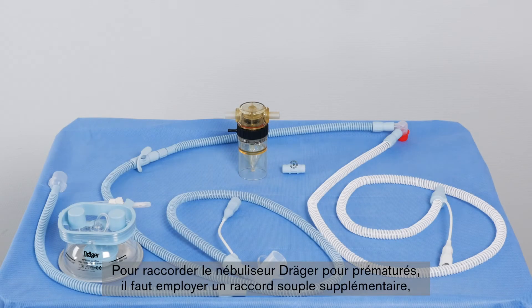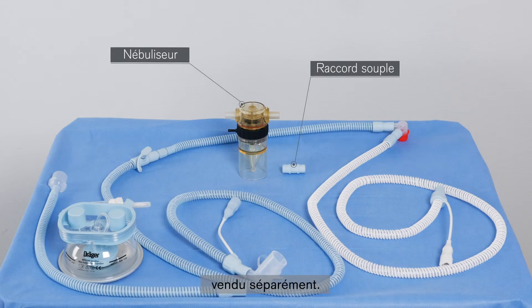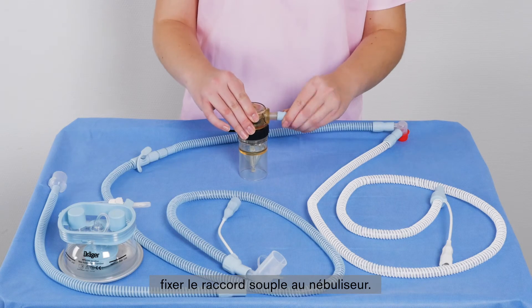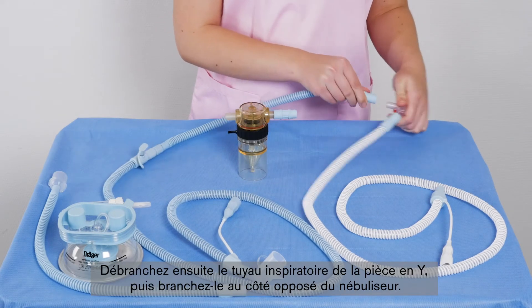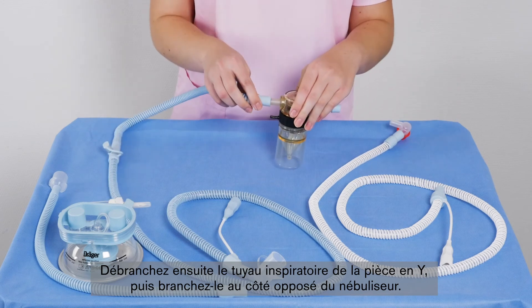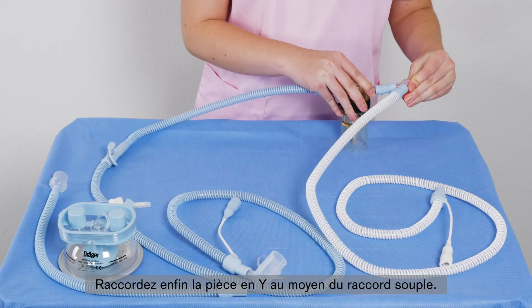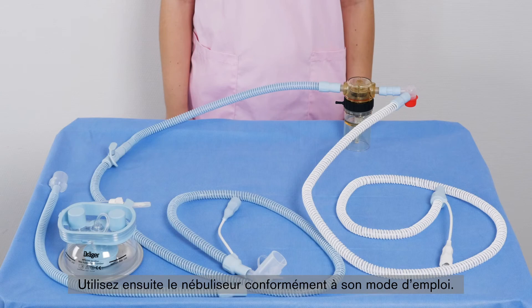It is possible to connect the Draeger medication nebulizer for premature infants by using an additional soft connector, which is available separately. Fasten the soft connector to the medication nebulizer. Then remove the inspiratory hose from the Y-piece and connect it to the opposite side of the nebulizer. Finally, connect the Y-piece of the system using the soft connector. Use the nebulizer according to the instructions for use.